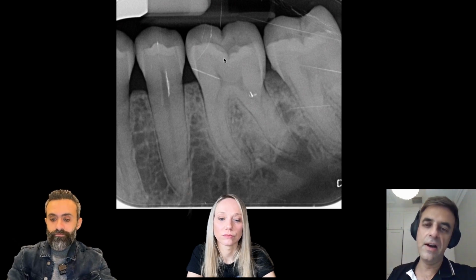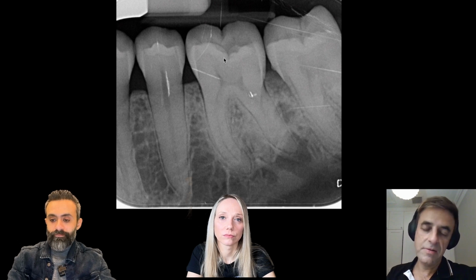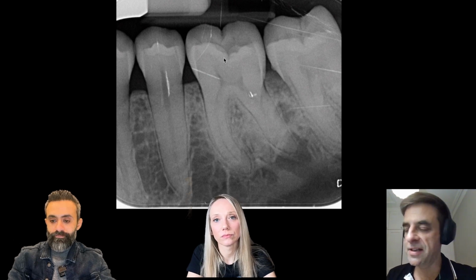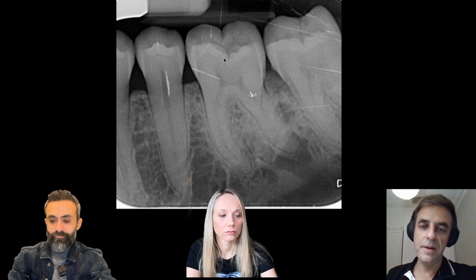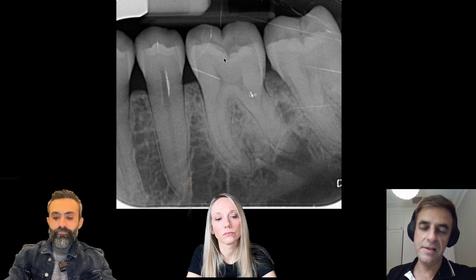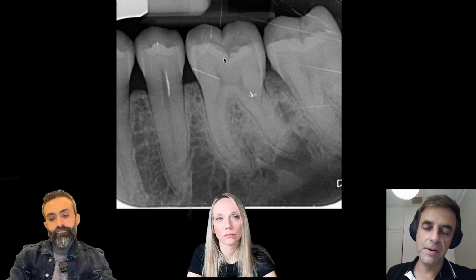Now, I would say that there are cysts and things like this that can involve the tissues around the tooth and not be from an infected root canal. So even if the tooth tests vital, it might be something like this. And so CBCT is really handy here just to rule that out. Even if you're thinking, oh yeah, that tests vital, it can't be a root canal problem, there are cysts and various problems that can cause radiolucencies in the mandible that aren't just apical periodontitis from an infected root canal.